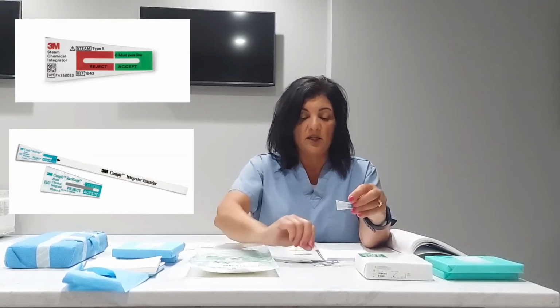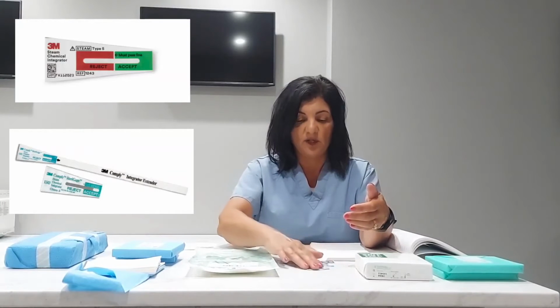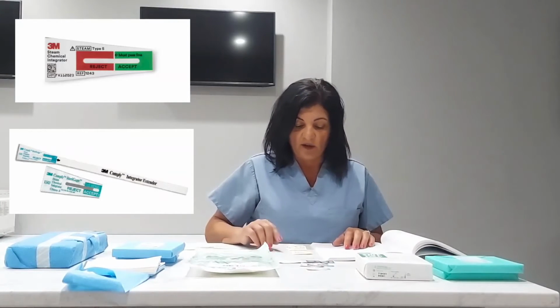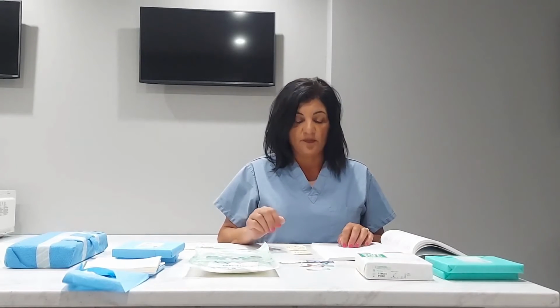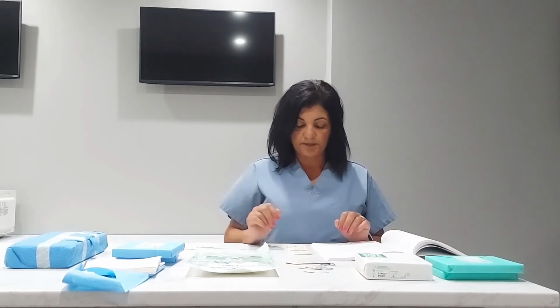And again, whatever your facility uses, these are just some examples that I had to show you. So those are equal to or exceed the requirements for a biological. So these are pretty much the industry standard as your type 5s.